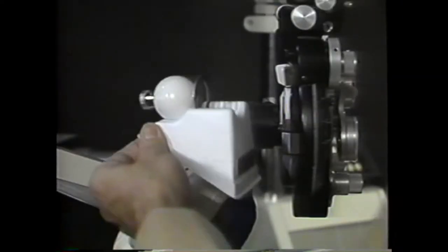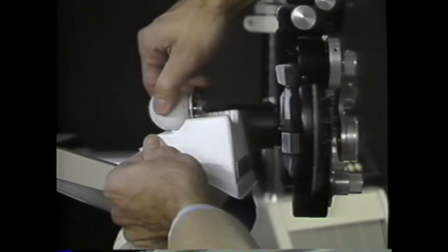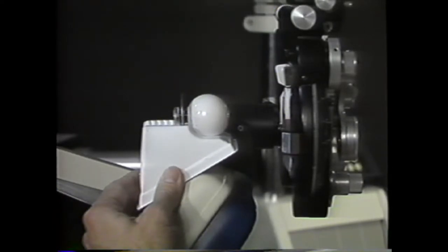Astigmatism can be added to the schematic eye with a cylindrical trial lens, and this will be done to create unknown refractive errors for practice purposes later. This Copeland Rynek schematic eye from Benson Optical Company can be used if it's first rotated 180 degrees, with cylindrical lenses being taped on the back of the phoropter.